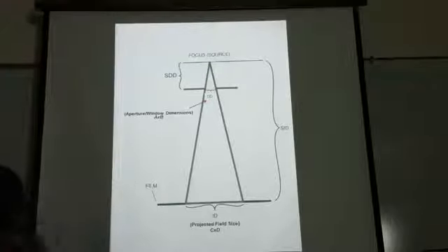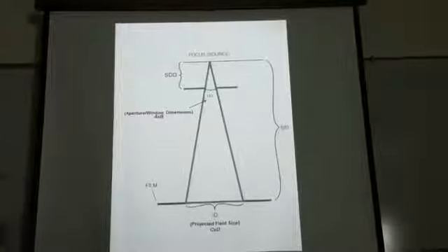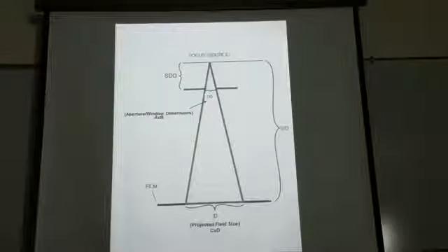Okay, and everybody knows what SID is, right? Source to image distance. Any questions? All right, let's go ahead and move on to the next slide.